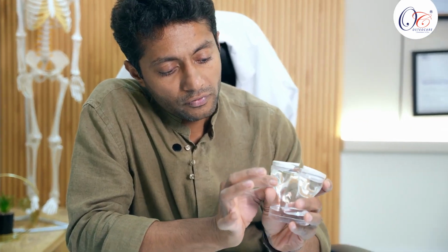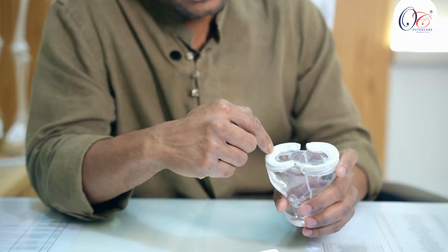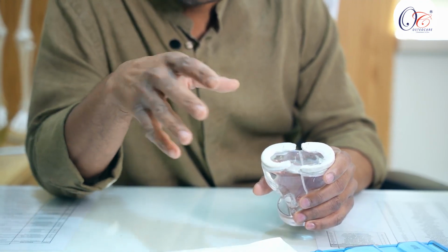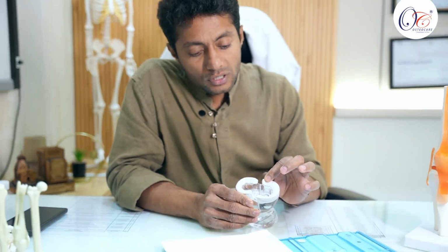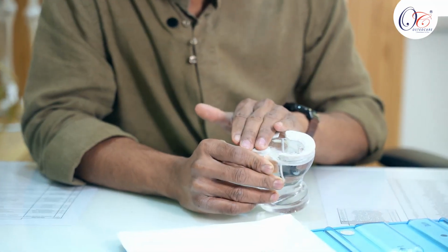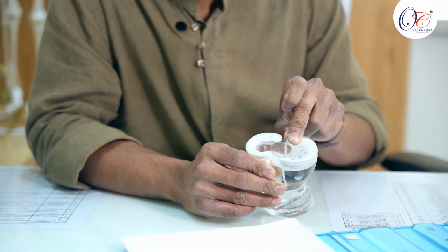For you to easily understand, we have removed the thigh bone and we are just showing the knee joint in the form of the leg bone, which is called the tibia, and also the two menisci. This is called the lateral meniscus and this is called the medial meniscus. These menisci are very commonly injured in road traffic accidents, high velocity trauma like sports injuries, and also with increasing age. This is called the posterior root of the meniscus and this is called the anterior root of the meniscus. Likewise, this is the posterior root and anterior root of the lateral meniscus.